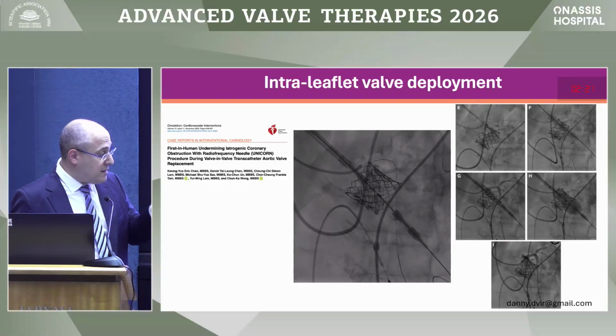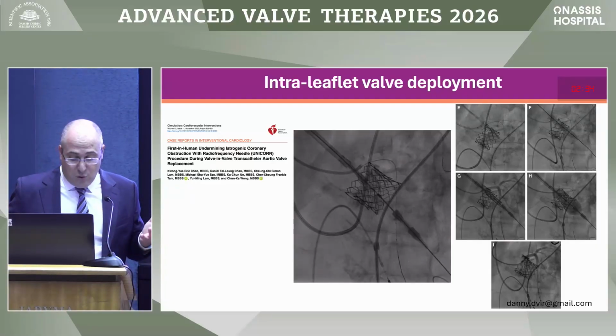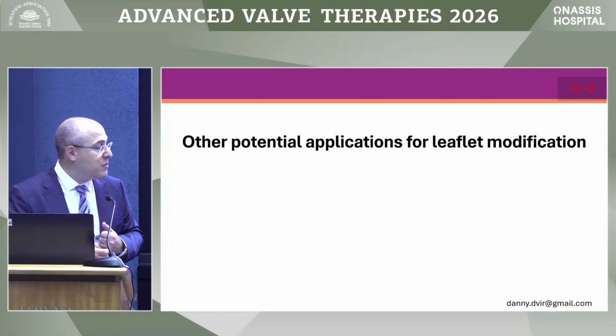When you start to bring catheters to that gap, you can push part of the leaflet towards the ostium of the coronary and then make the patient unstable. Or we have stent issues sometimes in these conditions, and it's difficult to come back to the coronaries afterward. But Batman or unicorn are becoming more common in the field of leaflet modification.